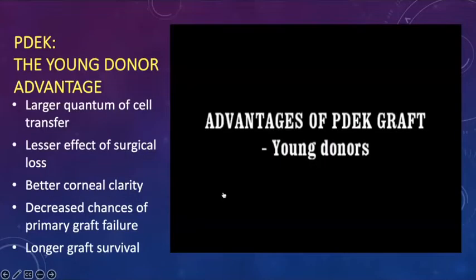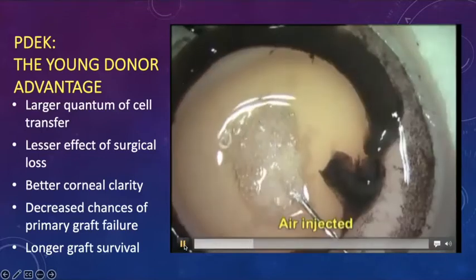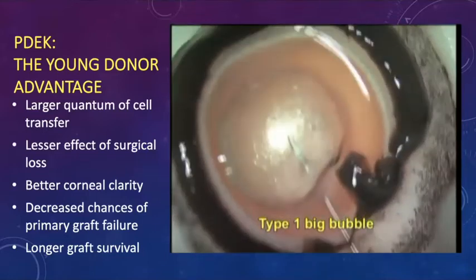On the other hand, the PDEK graft is very different. It starts from the center. It's very much like a Dua's big bubble. It starts from the center and it expands to the periphery. And there is a limit up to which you can enlarge it.